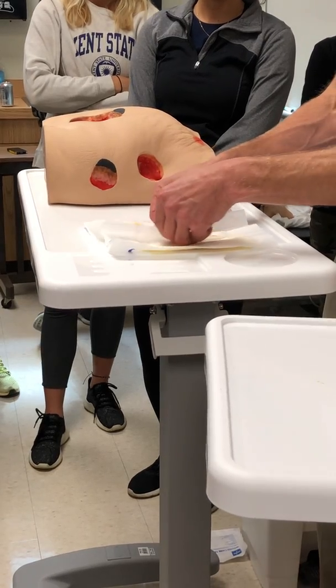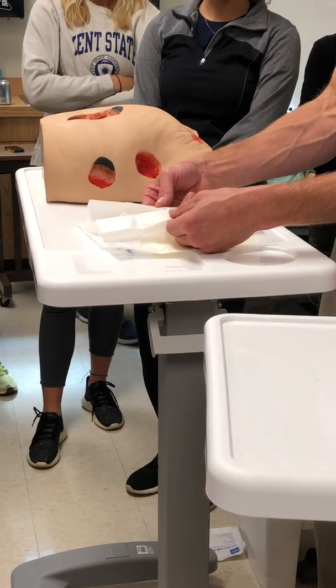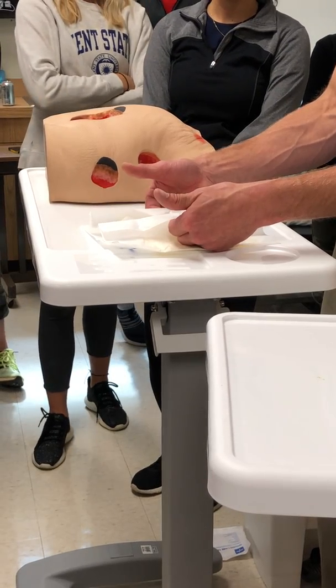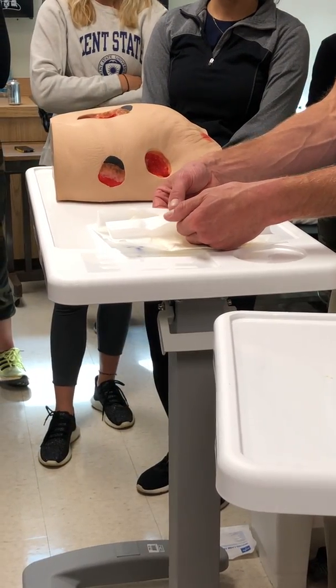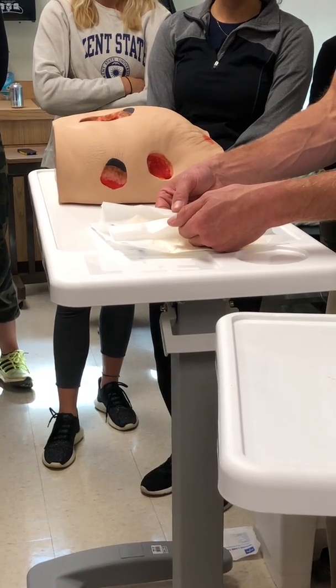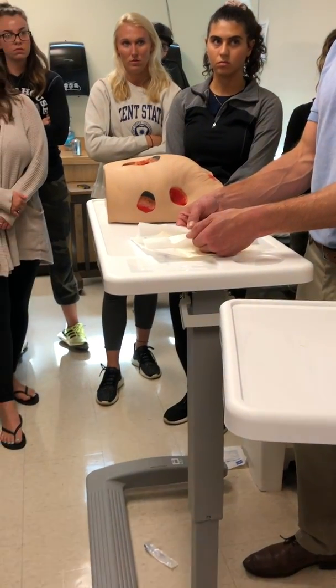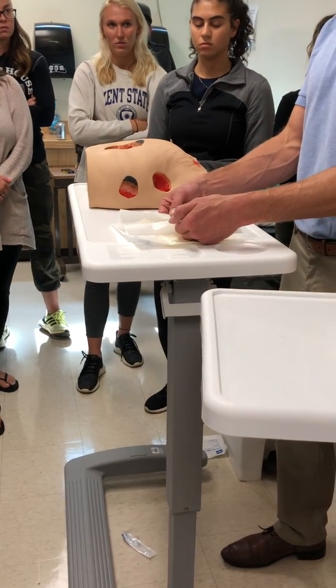With sterile fields, we say you can never grab the 1-inch border. This is the exception to the rule. You never get to grab the 1-inch border except for gloves that you're putting on because they come with a flap like this. After that, the 1-inch border does not get touched by sterile gloves. It does not get touched by non-sterile gloves. The 1-inch border does not get touched. It's a no-fly zone. Nothing can touch the 1-inch border of any sterile field except for putting on gloves the first time.